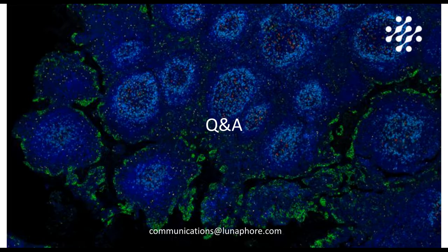So we would like to increase the number of markers that you could detect using TSA techniques on LabSat. So we are currently working on a proof of concept to go up to 8 markers at a time on the same slide, while at the same time offering more options in flexibility and template adaptation, like more incubation times or different temperatures.